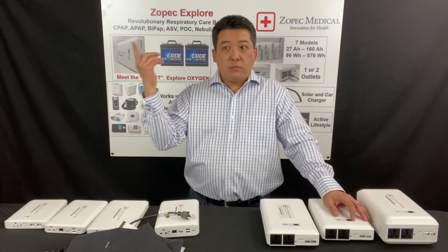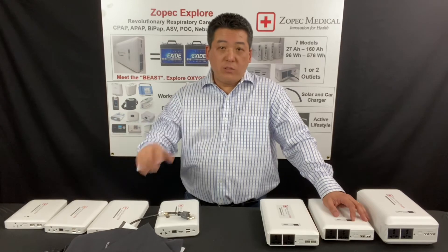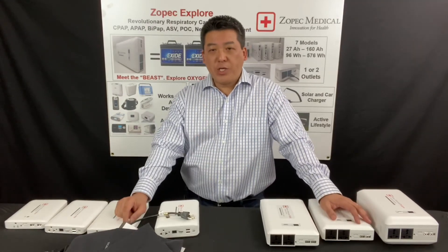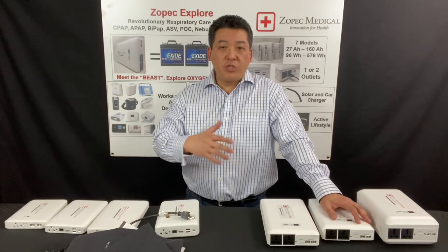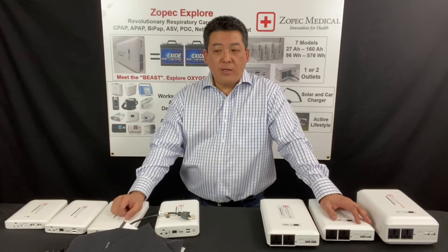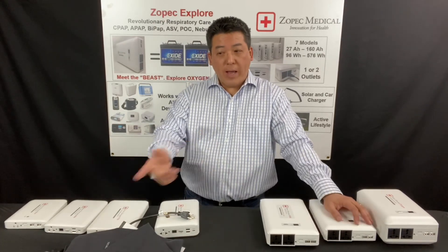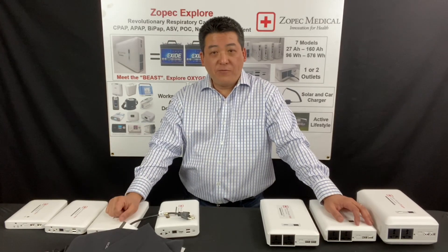Our batteries are in the air right now transporting COVID-19 patients from ICU to ICU, running the humidifier Fisher & Paykel Airvo 2 — very powerful with lots more applications. Please check out our video specifically for that. Additionally, our batteries have unlimited linking — you can link as many batteries as you want across models to have more power. Also available: troubleshooting and warranty information. Please visit Zopec.com for more information. Thank you.